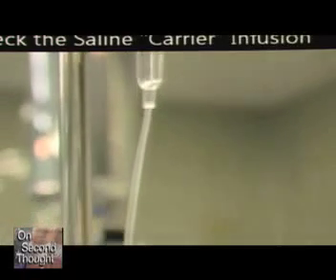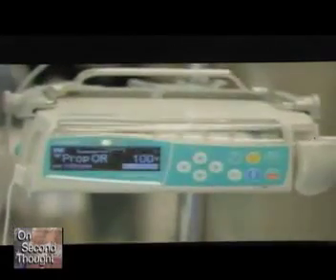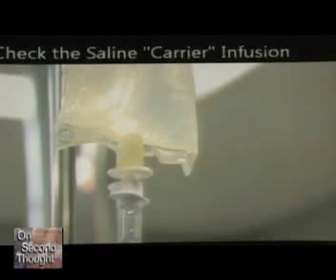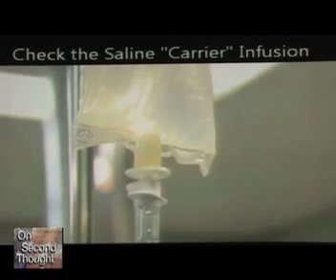Now, here's the saline carrier infusion. Please go back. Stop. Okay, actually go a little bit forward. Stop. This is the bag that I just showed you. Remember I talked about the spike. That's the spike right there. This is the piece of white plastic that is shoved through this.